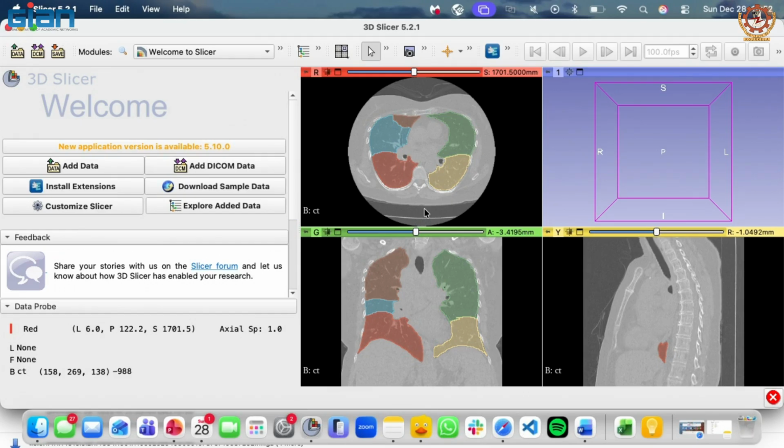Sometimes, once I tried to run my own segmentation model in a very low resource setting, I did not train it fully, just to try out, and then the lobe segmentation was outside the lung. Yeah, I mean, that's also a good learning, right? If you are segmenting lung lobe, it should never be outside the lung.